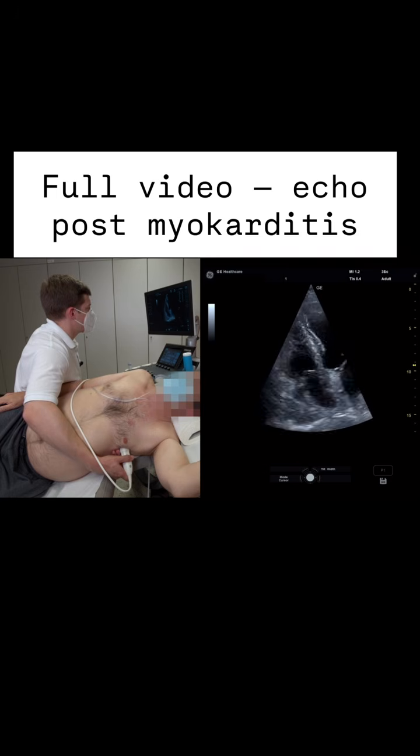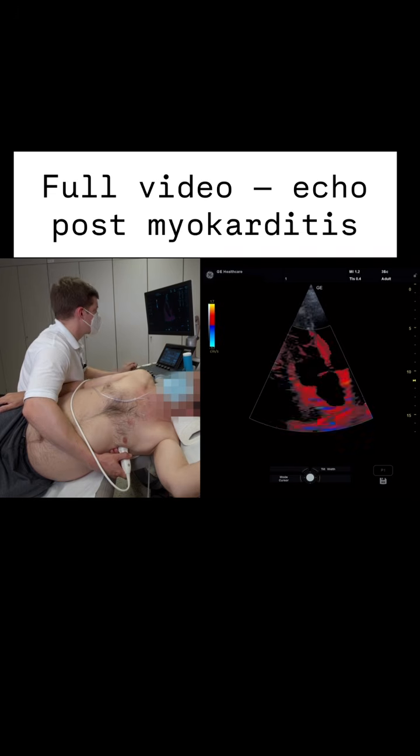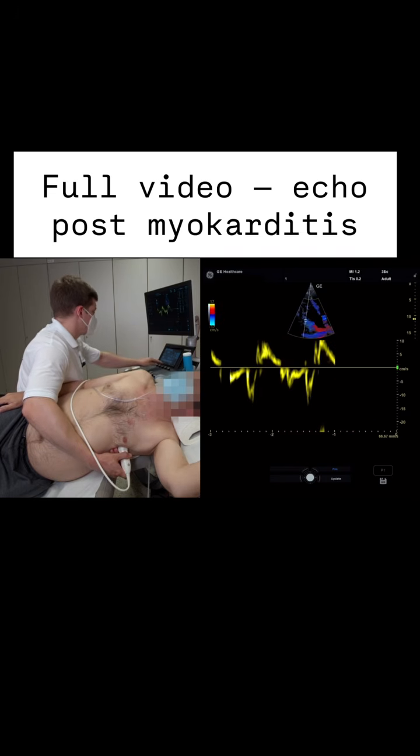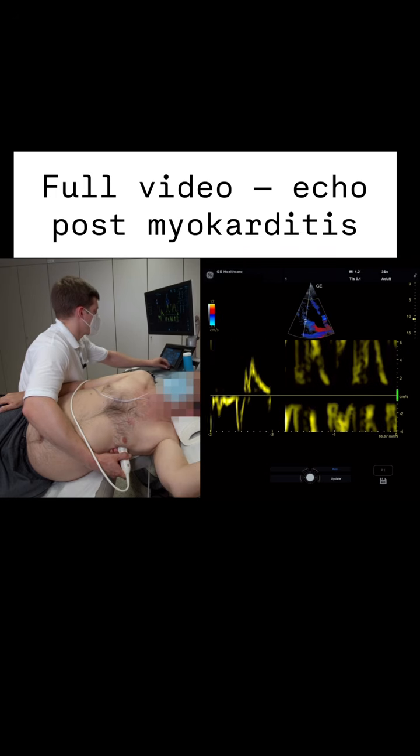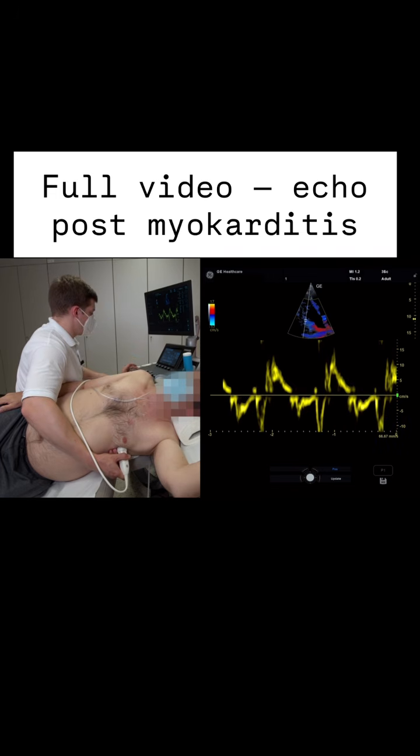One more thing we want to see is if the right ventricular function is normal. To me, it seems globally borderline, so we use the tissue Doppler, and when we adjust it properly, we see that the basal parts, we can verify that it is contracting normally.